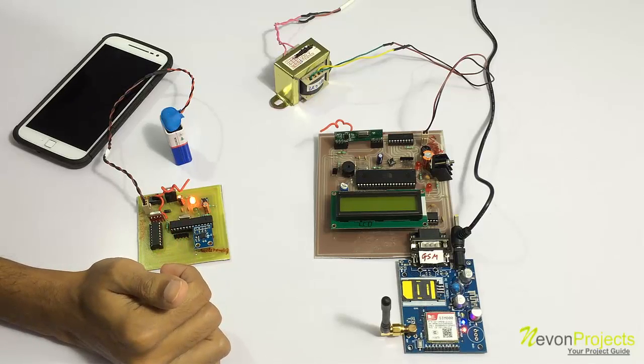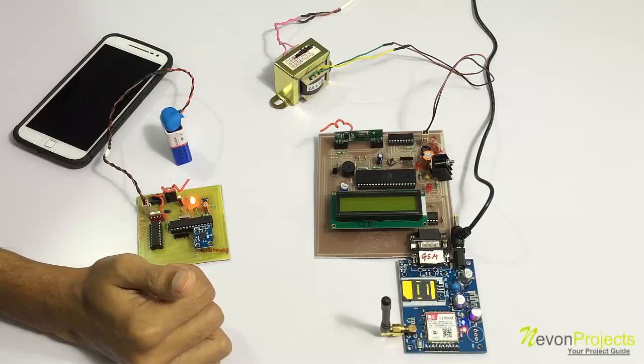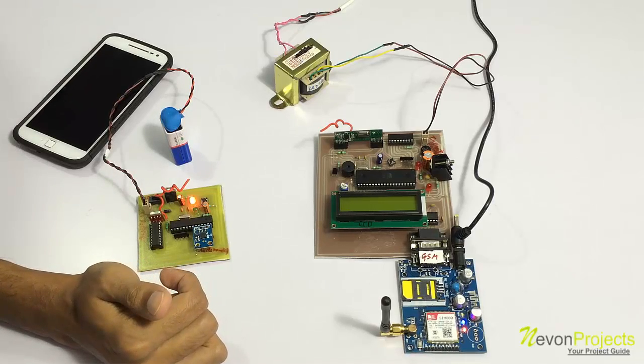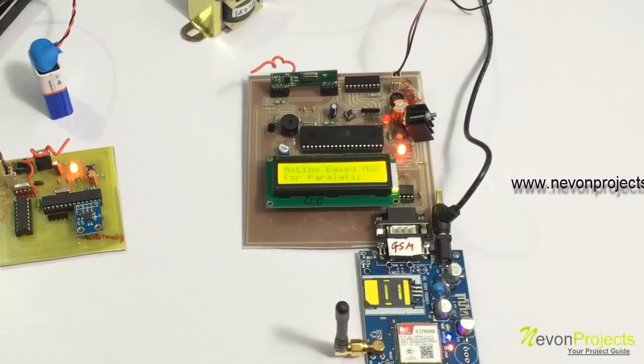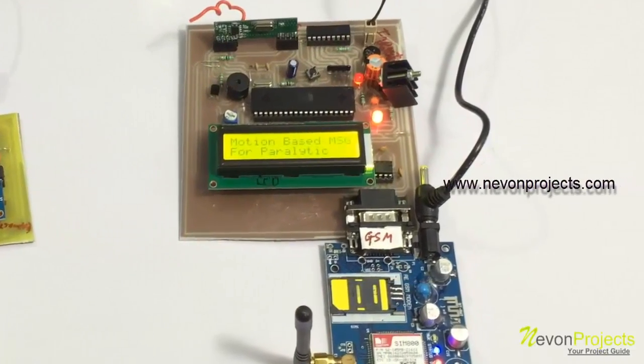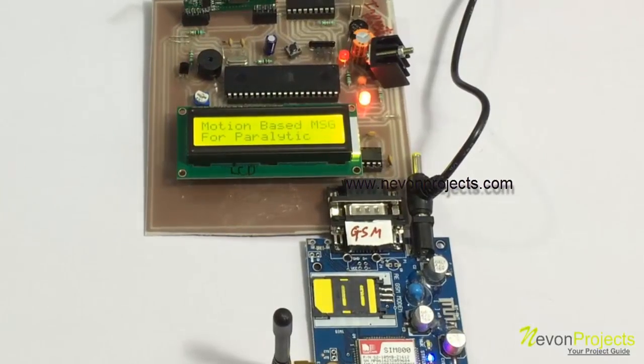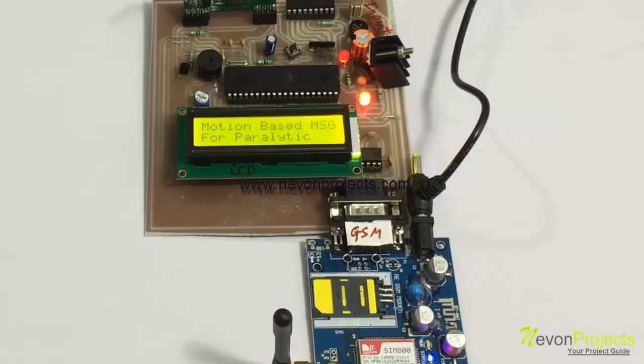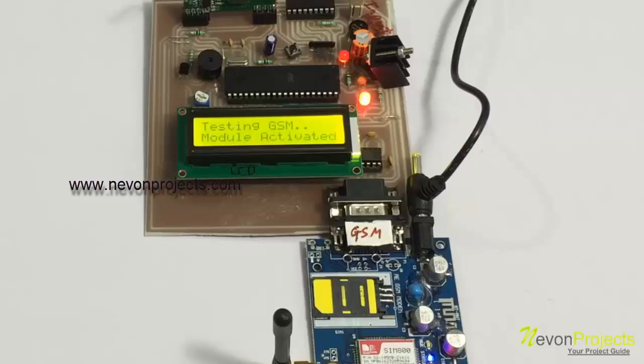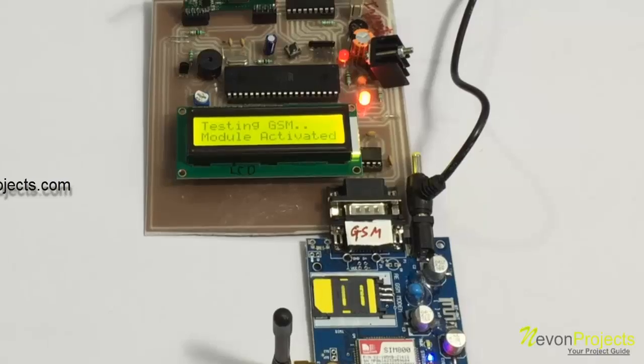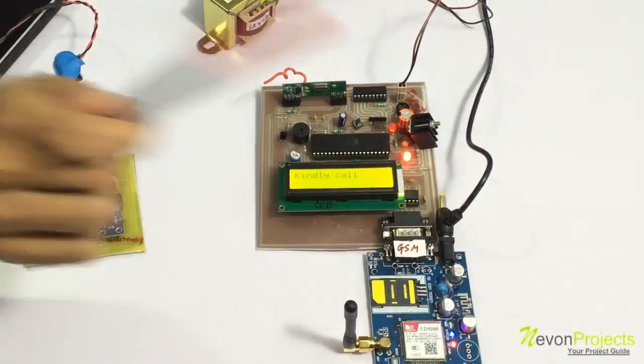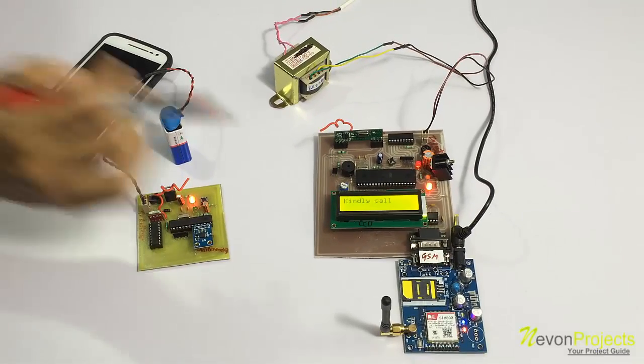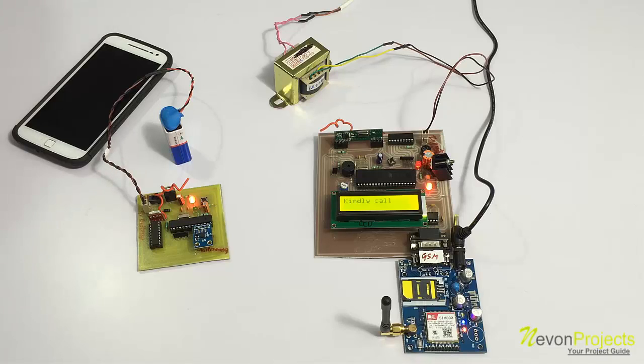Now let's turn on the system to see how it works. The system has been turned on now and it will now wait for us to call on this particular number here.